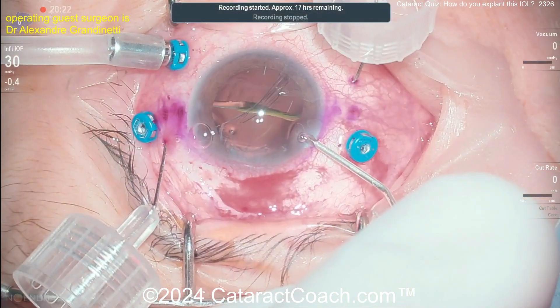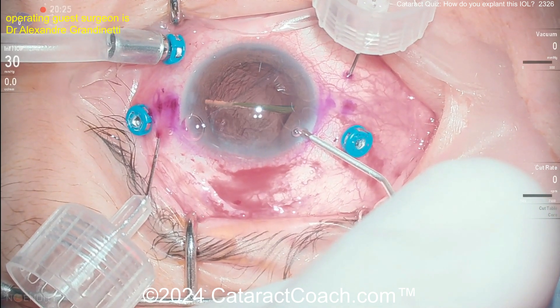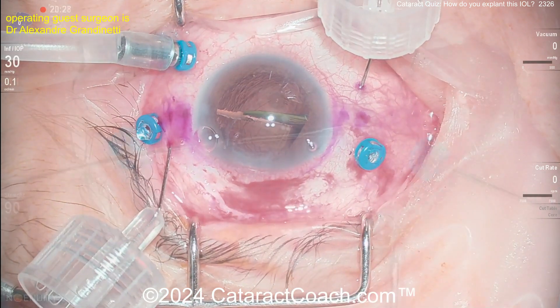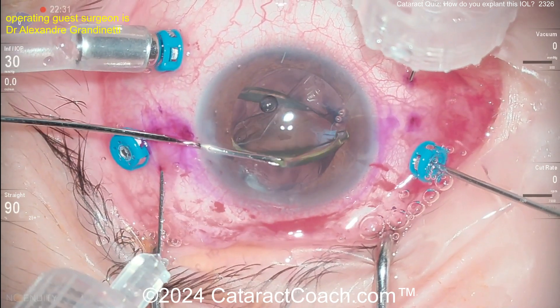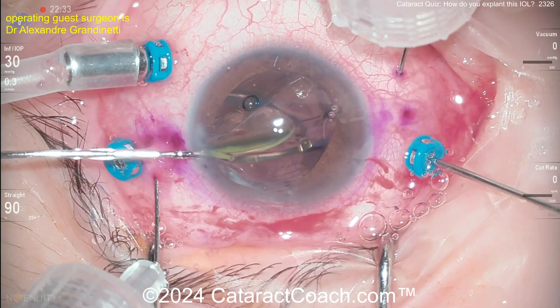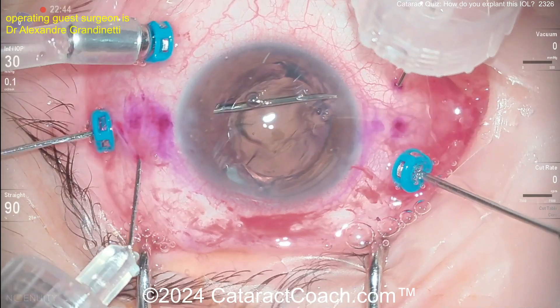We've shown the twisting-out technique to bring the lens out through a small incision. The question is: will that cause corneal damage? What about cutting it inside the eye — would that be reasonable? If you don't want to be blamed for corneal problems, don't make a corneal incision.